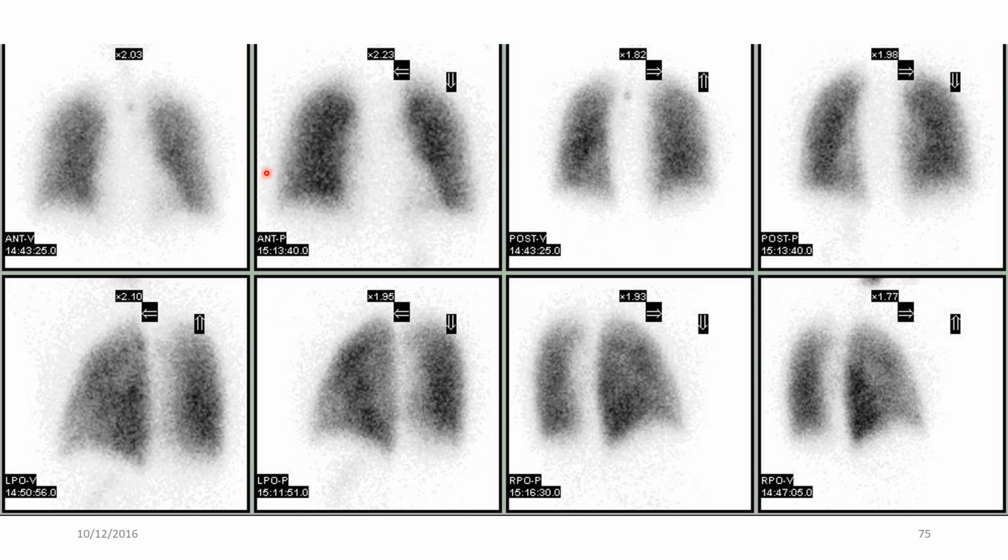And then we use, I can't remember the exact material because you don't really need to know it that much for this, another material that looks at the blood supply to the lungs. And all these are variants of those images with different views, whether it's anterior, posterior, and we do left and right obliques, showing the lungs quite nicely. The lungs do show up quite clearly on these, but as you can tell, they are kind of like potatoes. Well, the image quality is about as good as a potato.